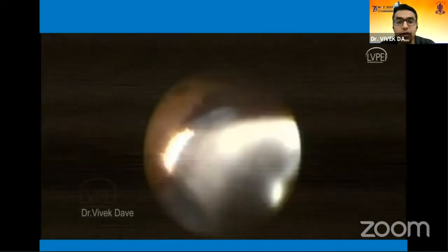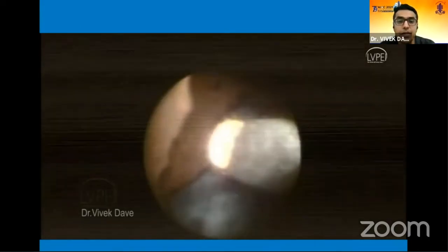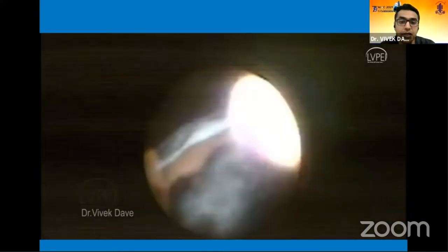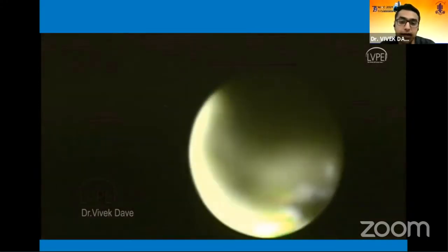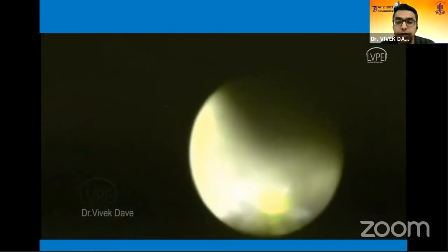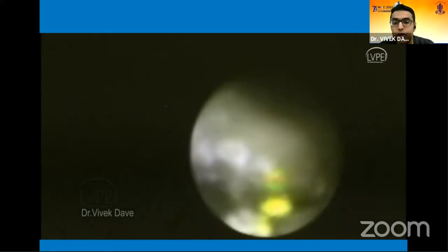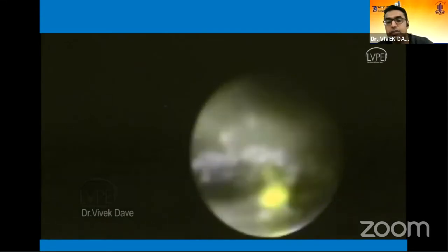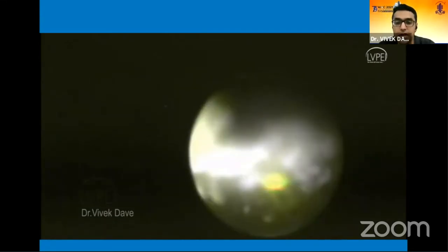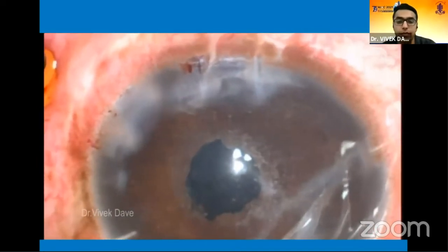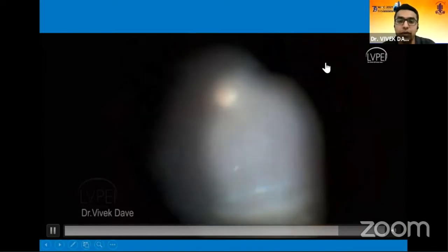When we go completely close to the base there is a risk of injury to the ciliary body and hemorrhage. That is why, once we remove the entire membrane, instead of attempting excision at the base, we photocoagulate it. This is pigmented tissue that takes laser photocoagulation very well. Confluent laser at the base — similar to what you do in retinopathy of prematurity — helps ensure all those cells are destroyed.